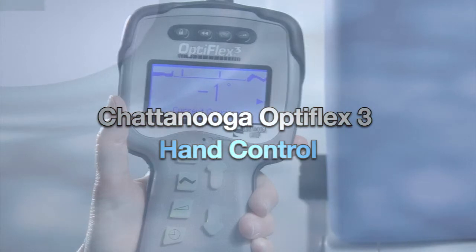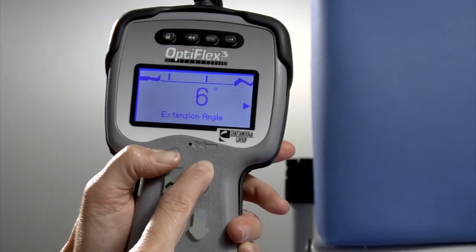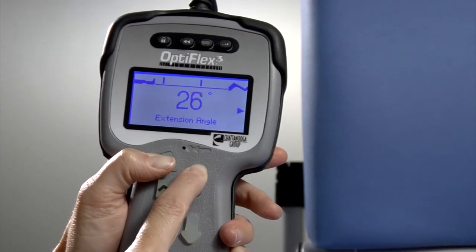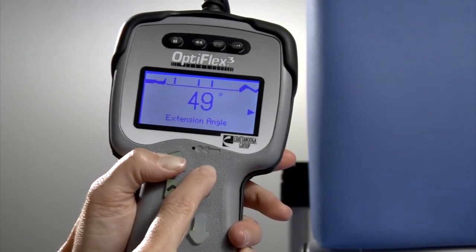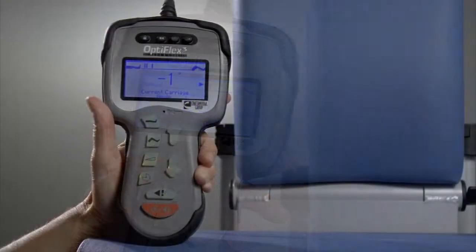The range of motion on the Optiflex 3 will run from -10 degrees of extension to 120 degrees of flexion. To adjust the range of motion to your prescribed or desired limits, start by holding down the extension button. This is symbolized by the picture of the straight leg. Set your desired extension limit by using the appropriate arrow.